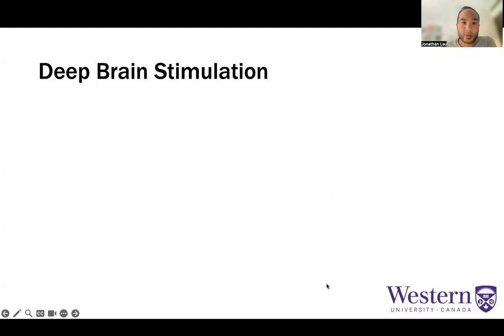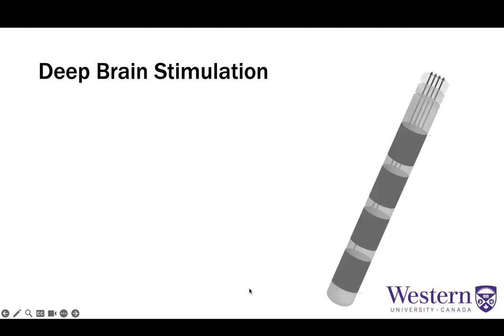I'll start off with some clinical context. In my practice as a surgeon practicing functional neurosurgery, one of the most common procedures I perform that requires improved thalamic imaging is a deep brain stimulation surgery. This specific procedure involves implanting electrodes, about 1 to 2 millimeters in diameter, about 7 to 10 centimeters deep into the brain, into small targets.